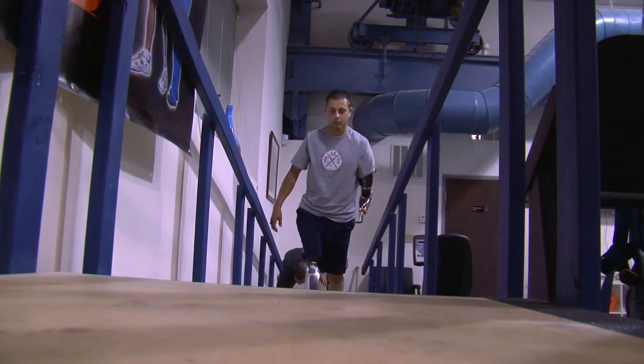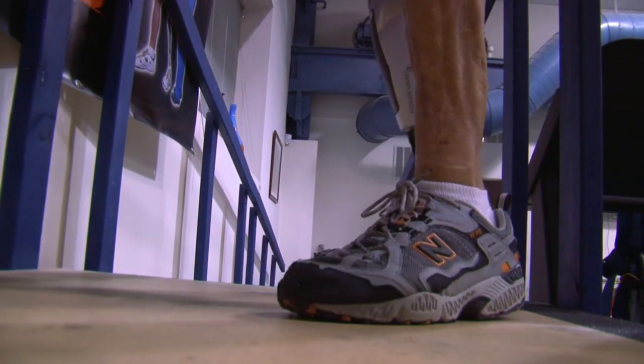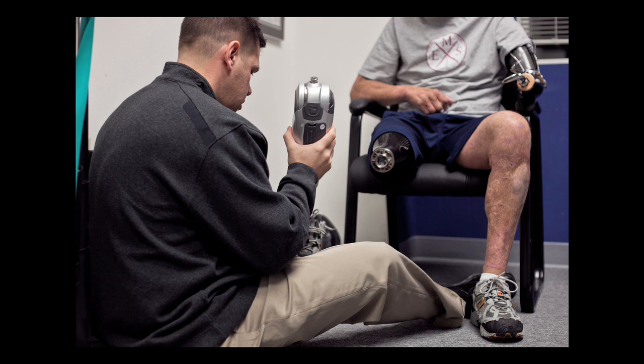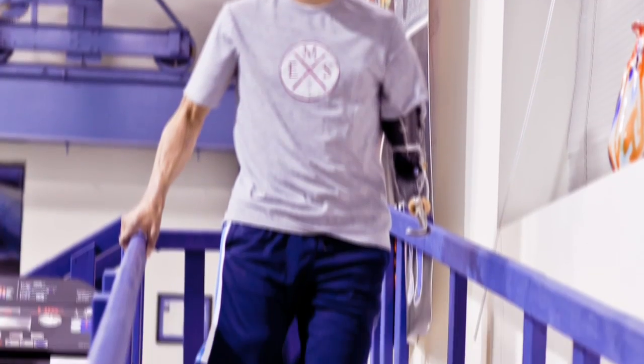For an above-knee amputee, stairs, ramps, and uneven terrain are huge environmental barriers that pose a huge risk. So with losing two joints, the more function we can return in the prosthetic device, the safer these guys are going to be and the higher they're going to function.